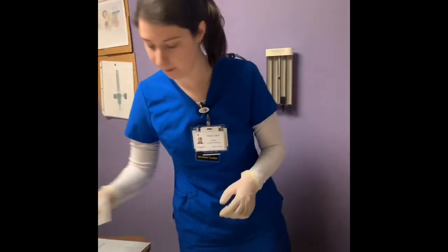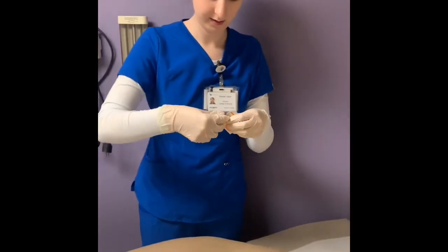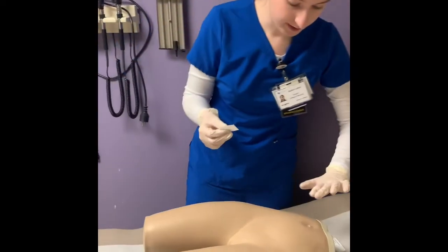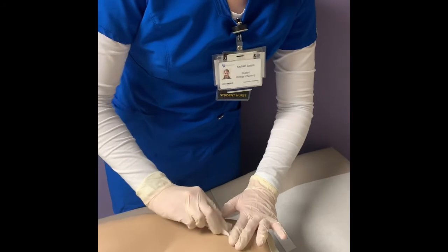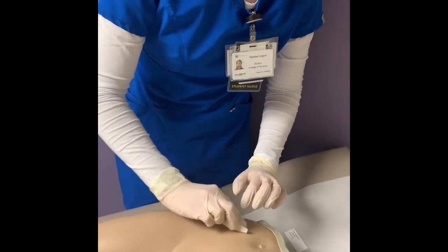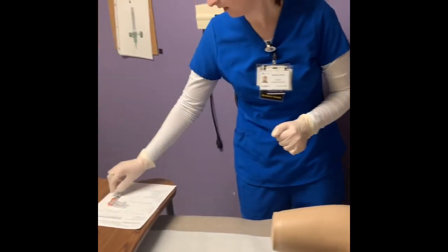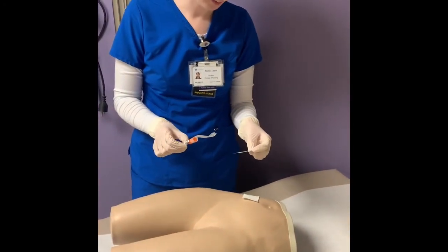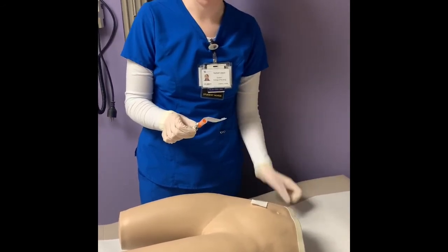I'm gonna go ahead and grab my alcohol swab. I'll open it up now so that it's ready. Set that to the side. I'm gonna measure 2 inches from the umbilicus and go ahead and clean in a circle. Okay. Leave that to mark my spot, which is right in the middle. And I'm gonna go ahead and check one more time. This patient is Carmen Guadalupe. We have verified their identity with the MAR, and I have medication here for Carmen Guadalupe.